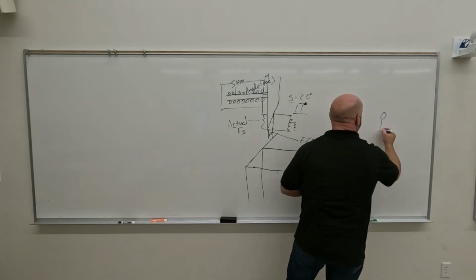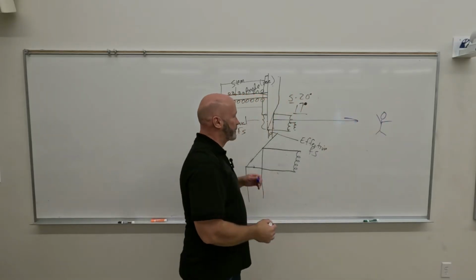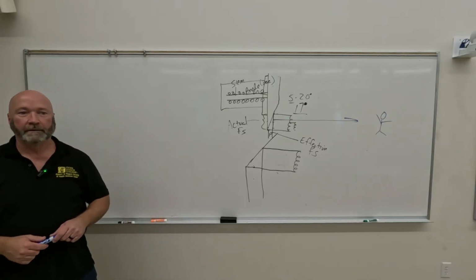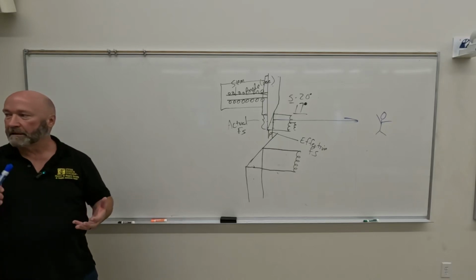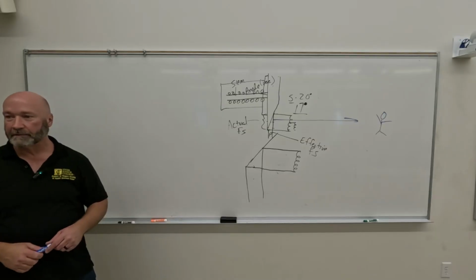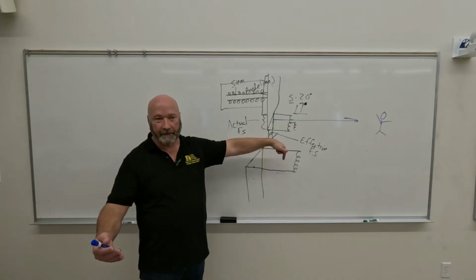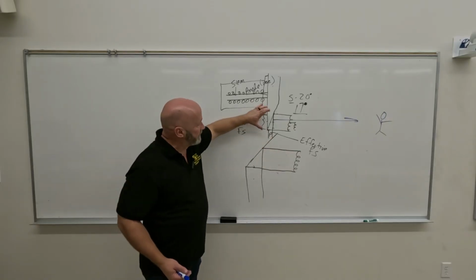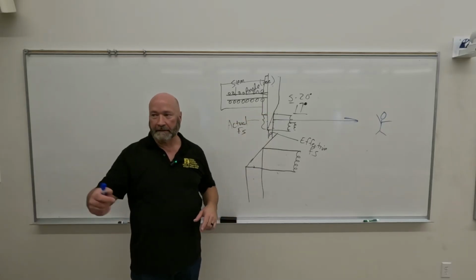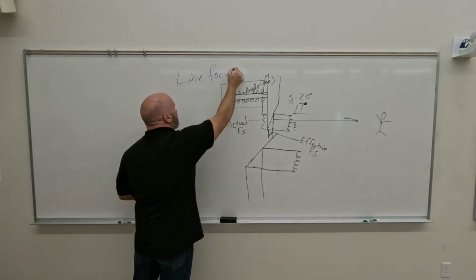If we put the patient over here, and we projected the X-ray beam back straight towards the cathode, what are you going to see on every X-ray image? You're going to see the cathode, the entire cathode, focusing cup, you're going to see both filaments, you're going to see everything that's on the cathode end of the X-ray tube. So we have to have it projected down like that. The benefit that we get out of it is we can increase our heat load and at the same time increase our sharpness of recorded detail. Again, that is the line focus principle.